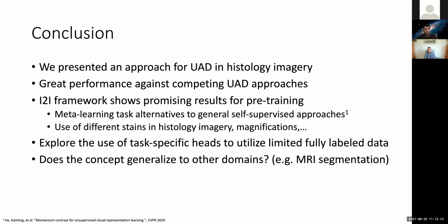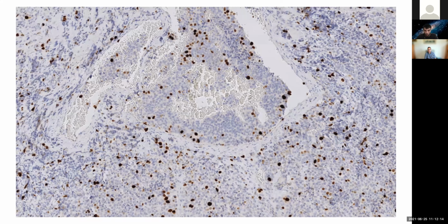What's the real bottleneck for the pathologist, as Jens already mentioned, is the analysis of the immunohistochemically stained slides. So for example, instead of detecting tumorous regions, they also need to quantify on a cellular level: what are the positive cells and negative cells, and quantify the positive stains.